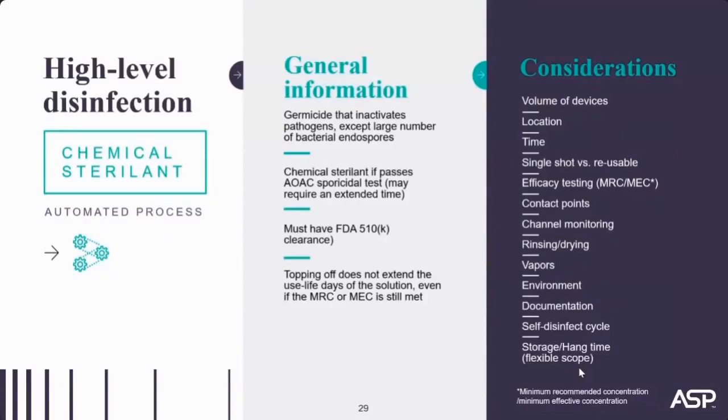Is the system a closed system for vapor control and therefore less staff exposure? What needed documentation is being captured on the printout? Is there a self-disinfect cycle, either thermal or chemical, available to prevent any biofilm formation of the internal components of the AER?